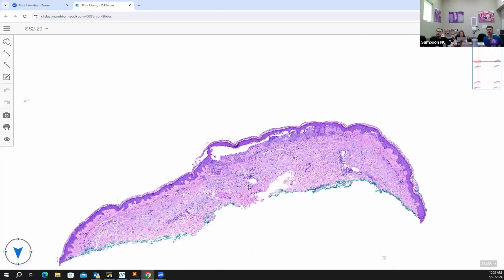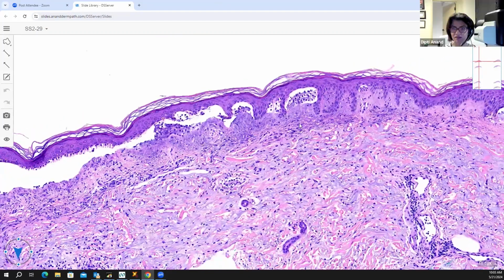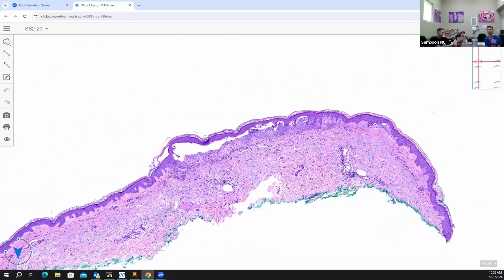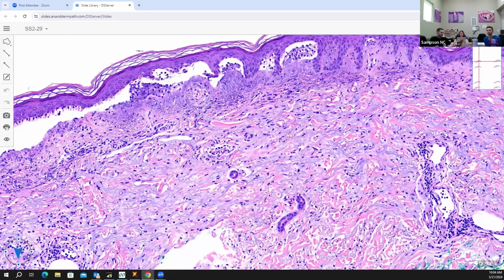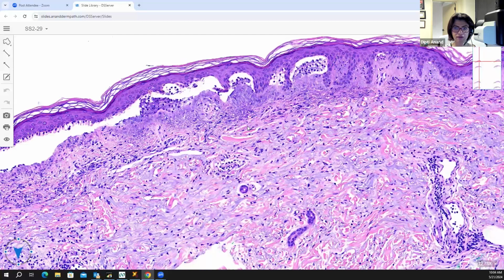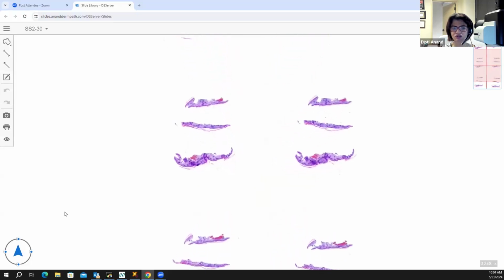On that last slide, it looked like we have a subepidermal split here, and predominantly neutrophils within. Exactly. My first thought was linear IgA, DH, or bullous lupus. Or chronic bullous dermatosis of childhood. Yep. Then they'll give you a second-order question and you'll pick it up. This is from a patient with linear IgA.